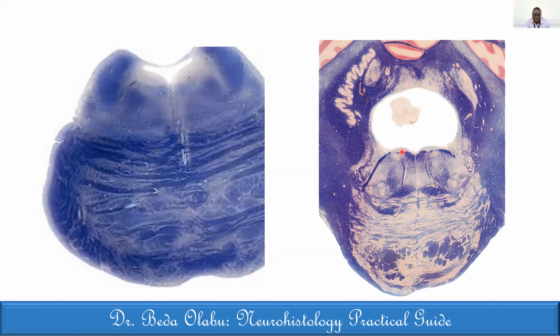Anyway, so focusing on pons, the dorsal part of pons is called the pontine tegmentum. This is the most compact part. It contains a number of things: cranial nerve nuclei, the lemniscal systems, reticular formation. They are found within the pontine tegmentum, and this is continuous with the tegmentum of midbrain. Then the ventral aspect is what we call the basal pons.